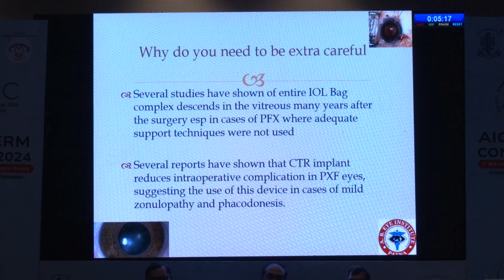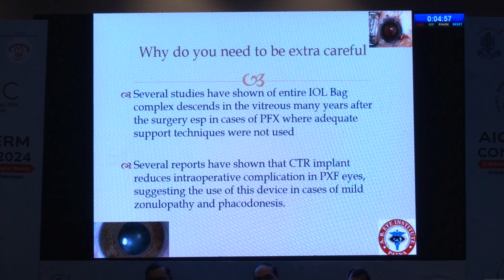Several studies have shown cases of the entire IOL bag complex descending into the vitreous many years even after the surgery, especially in cases of pseudoexfoliation where adequate support techniques were not used. Because even when we are doing the surgery, we are putting stress on the zonules. As it is, they are compromised from before, and we hurt them more and the zonules become even weaker.